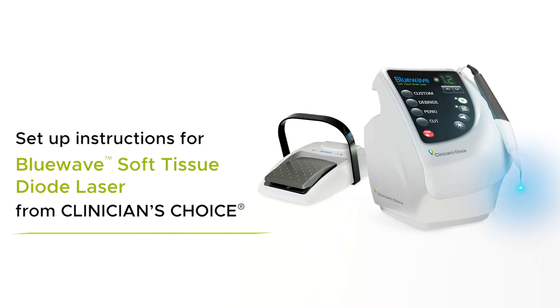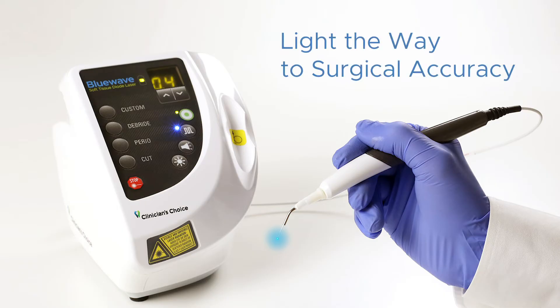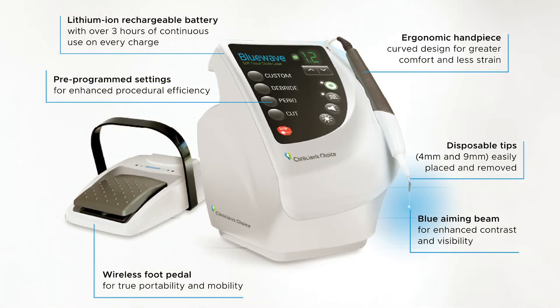Thank you for your recent purchase of the BlueWave Soft Tissue Diode Laser from Clinician's Choice. The purpose of today's video is to walk you through the setup instructions for the BlueWave, so you can start using your unit right away. Let's get started.